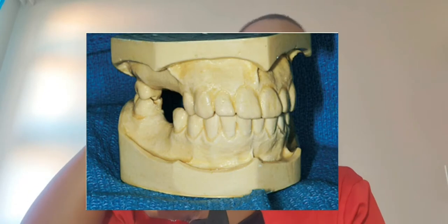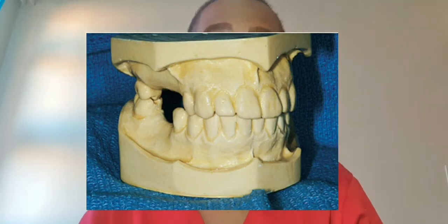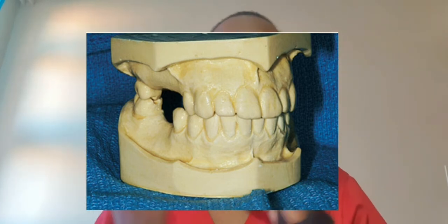We use it basically when less accuracy is required, but it is still able to bring out an accurate three-dimensional shape of a patient's teeth, as well as the surrounding structures. So in that aspect, yes, it's doing its job.